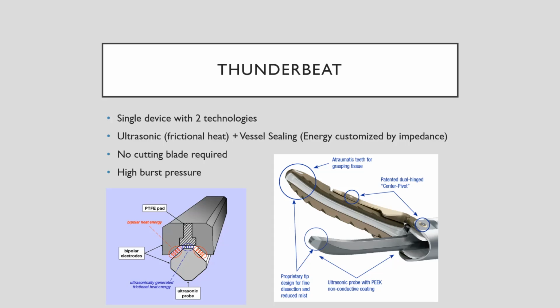And that is the reason probably why this device has been marketed as a reusable probe, if I'm not wrong. And one more thing which studies have highlighted is that Thunderbeat has, it seems, a high burst pressure compared to other devices. That's what some of the studies say. And plus, every company has their own unique feature in terms of jaw design, with more grip and these things. So you can personally evaluate what is good for you.